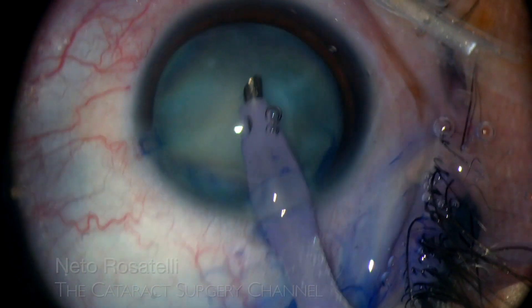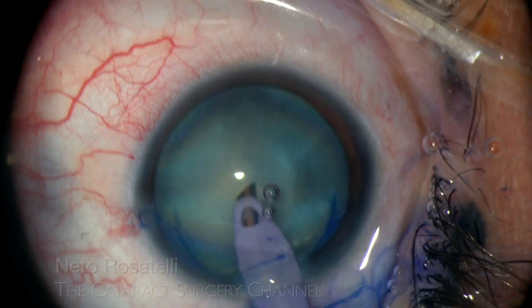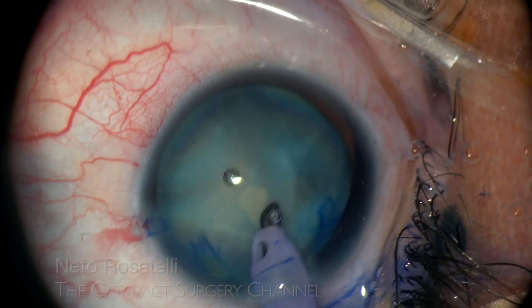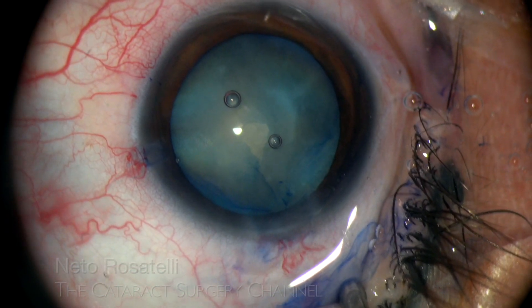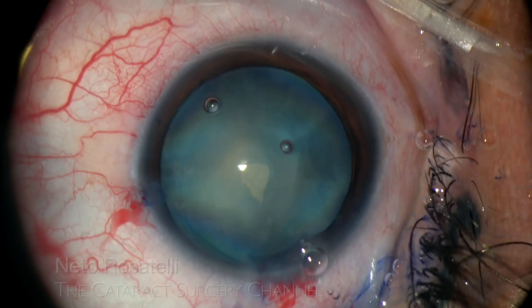Now I perform a focal capsulotomy to quickly decompress the bag and aspirate cortex milk. Here I slightly enlarge the aperture and probe to see if more fluid comes out. I was expecting a more intumescent one here, but that was not the case.